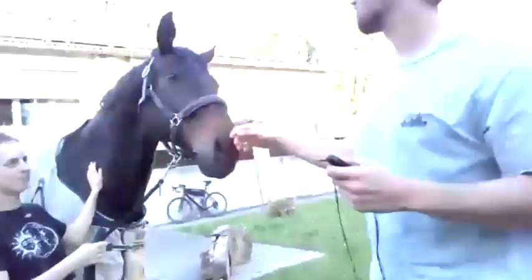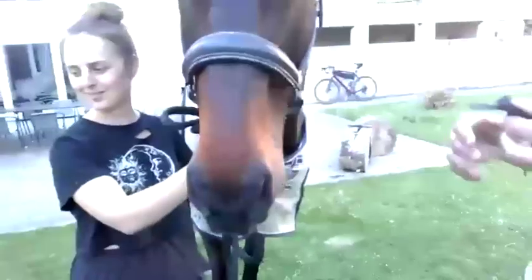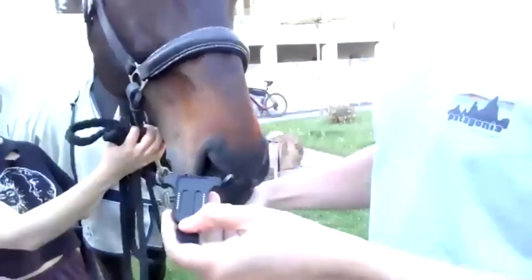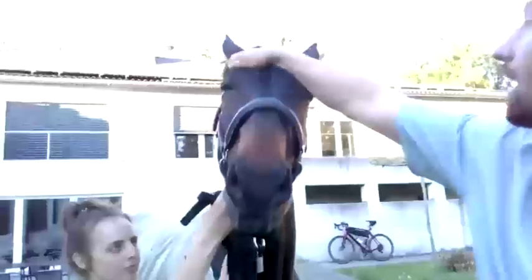You can see here Dreamy, she's already been here a while. She was grazing a lot. I guess she's very happy because she had a lot of nice fresh grass here from the garden at g.tec. We already did a couple of measurements with Dreamy, so she knows what's going on. She's a bit hungry. So I'll put the base station on her back, and then I'll stick the electrodes. For that, I also need to remove a bit of the hair.